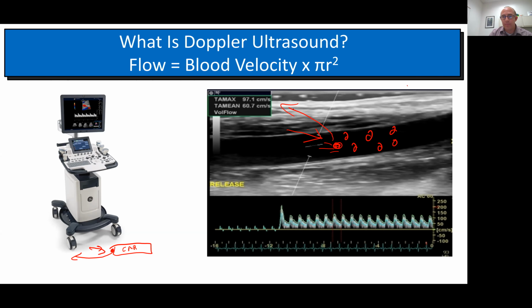So in this picture, we have the artery, the radius, or the diameter. To get the radius, you would just divide the diameter in half, right? And we also are getting the velocity. So this down here is the blood velocity. So we have two sets of sound waves, right? One set of sound waves gives us this picture, and that's called B mode or brightness mode. The other set of sound waves comes from pulse wave mode or PW mode or Doppler mode. It's called a lot of different funny things on different ultrasounds. It tells us how quickly the blood is moving.